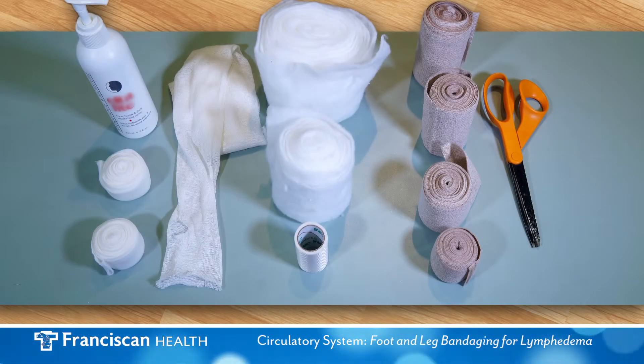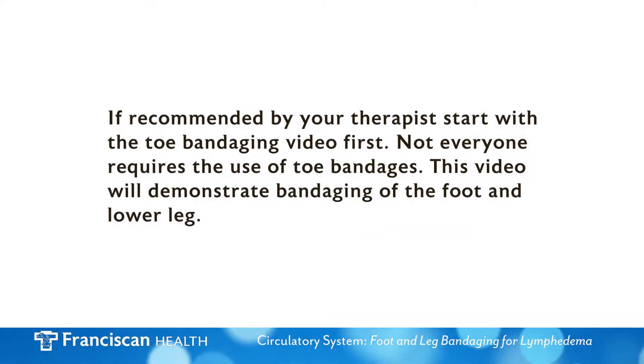Your therapist will make recommendations for your bandaging supplies. For the purpose of this video, we will be using these supplies. If recommended by your therapist, please start with the toe bandaging video first — not everyone requires the use of toe bandages. This video will demonstrate bandaging of the foot and lower leg.